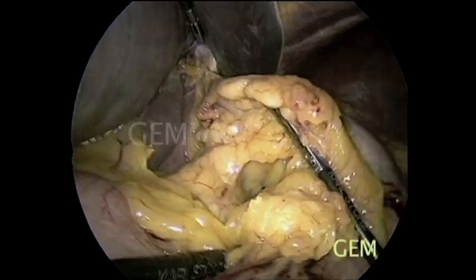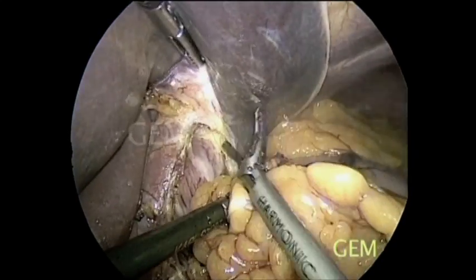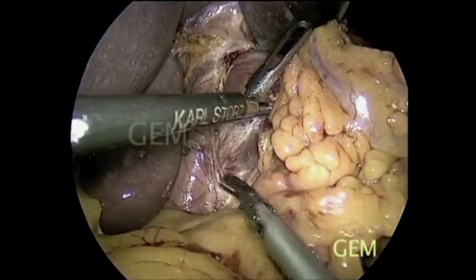The liver has been retracted with a 1.5 mm rod-type instrument. We mobilize the esophagus from both the right crus as well as the left, then move down retrogastrically.